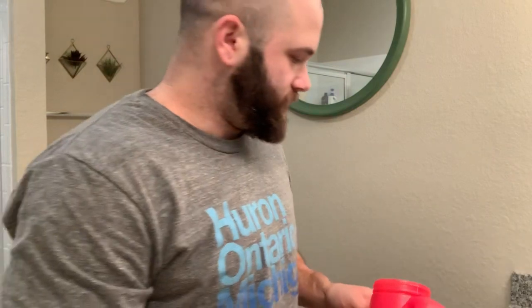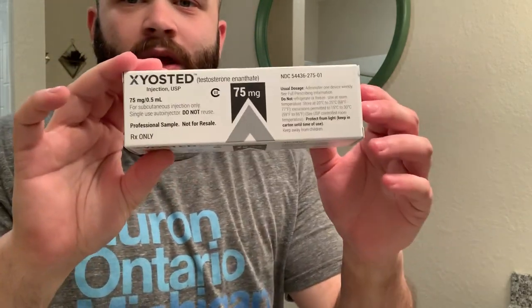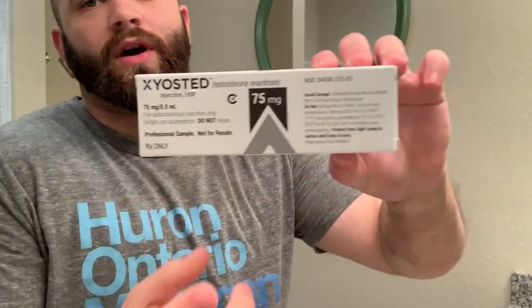This is a one-gallon container. For those of you who missed this last time, this pen comes in 50 milligram, 75 milligram, and 100 milligram. This is a 75 milligram. Normally I would take 100, but I got these as a sample from a doctor's office, so I'm trying the 75 milligram.